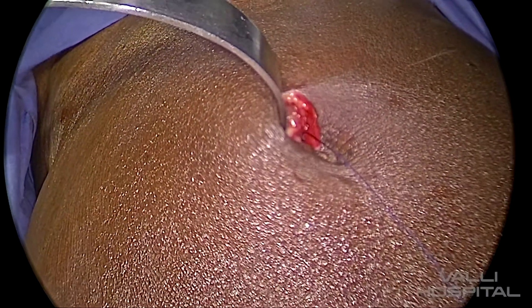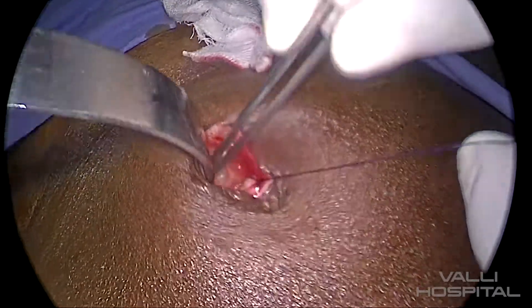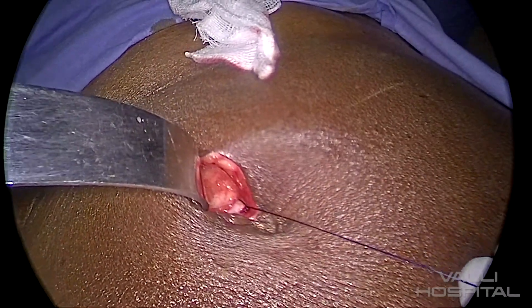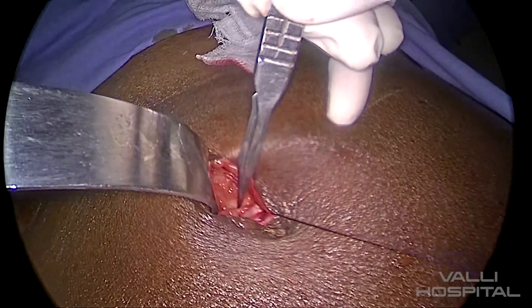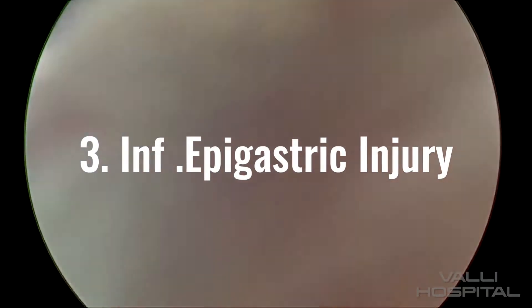Then you go laterally. Use a gauze piece, wipe nicely, and move all the fat away. Then you incise. When you take the 11 blade, you must have good control — support with the little finger.